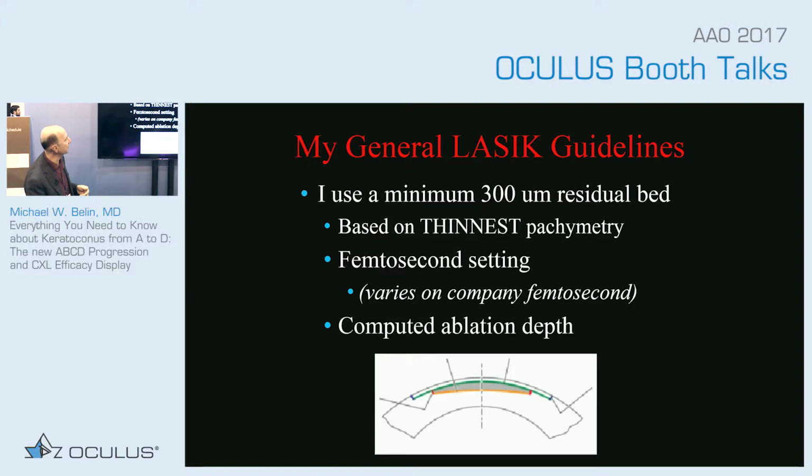Just keeps moving on its own. Okay. Again, I use a minimal 300 residual bed on my computations. It's based on the thinnest pachymetry.